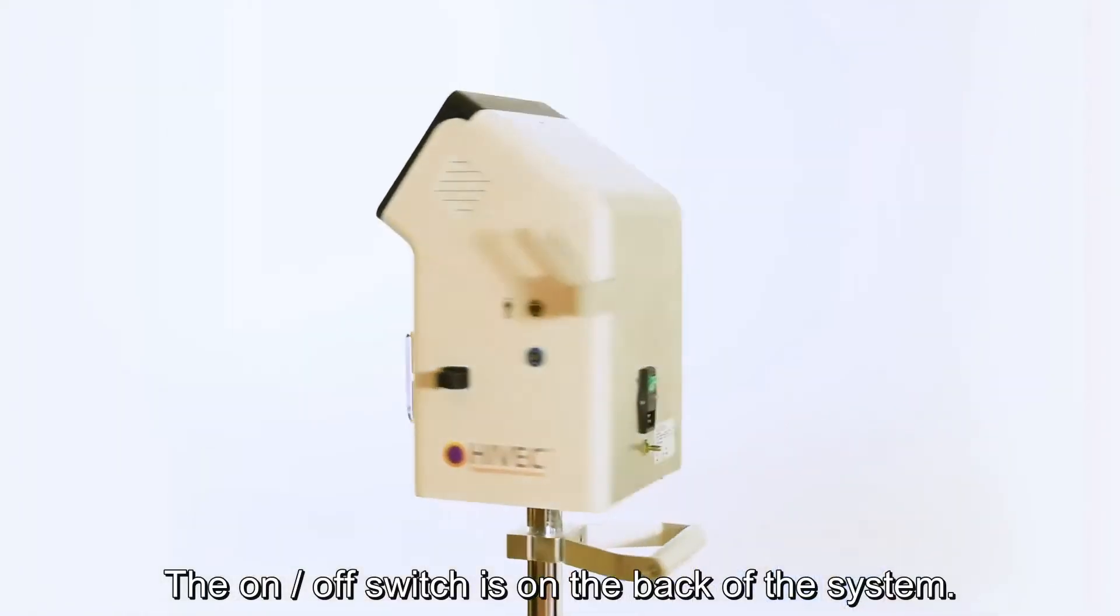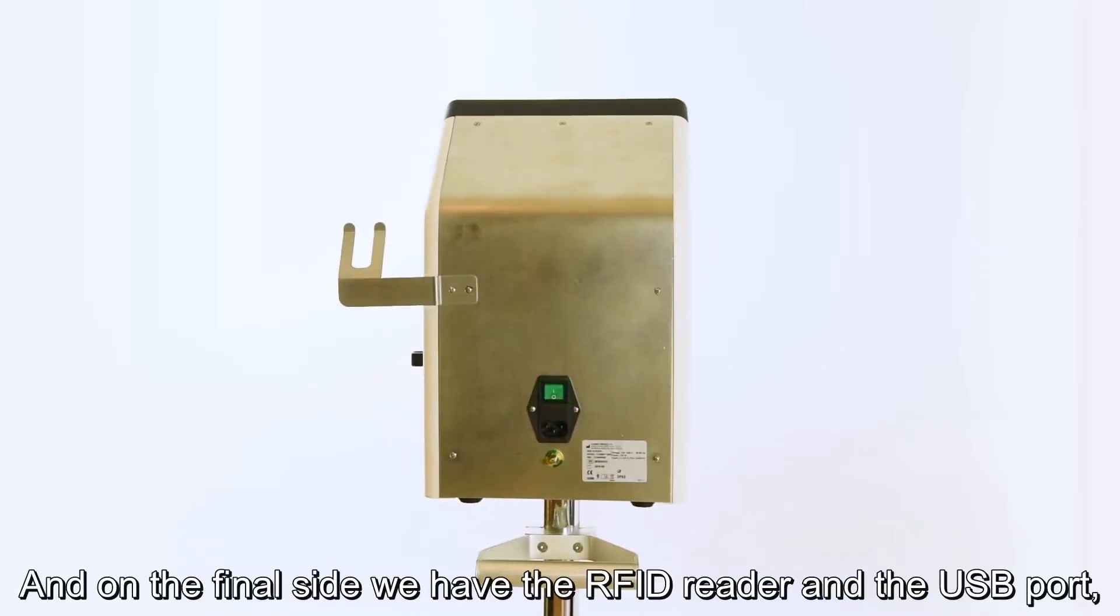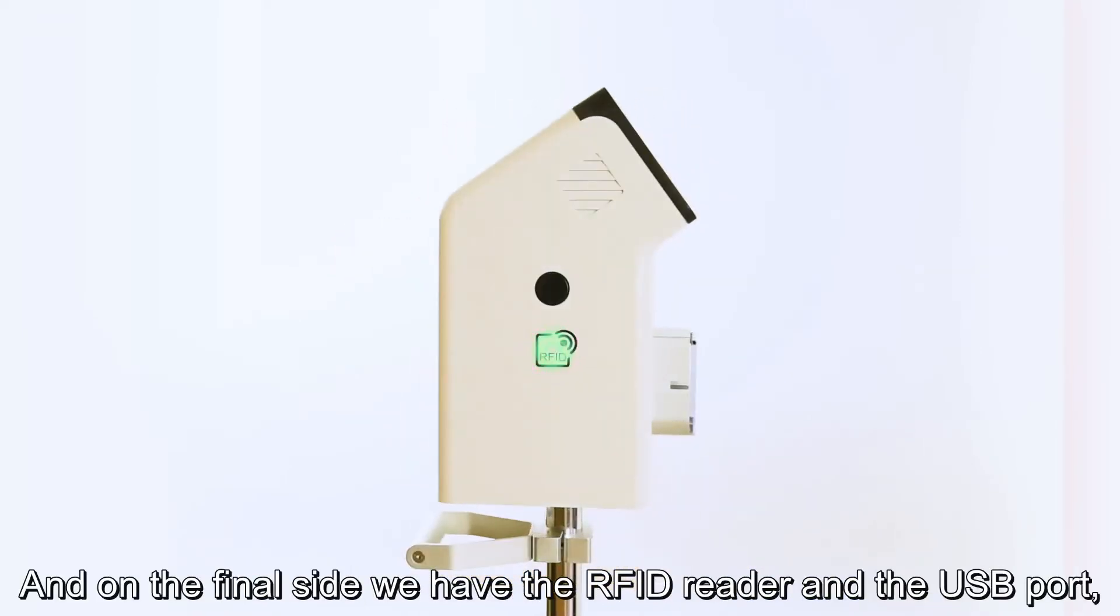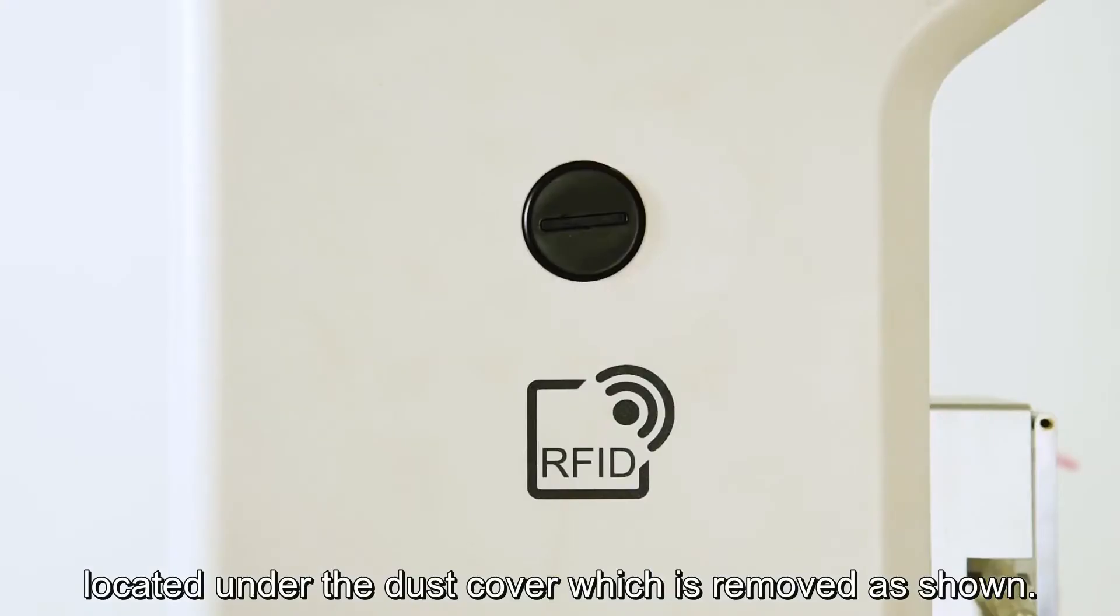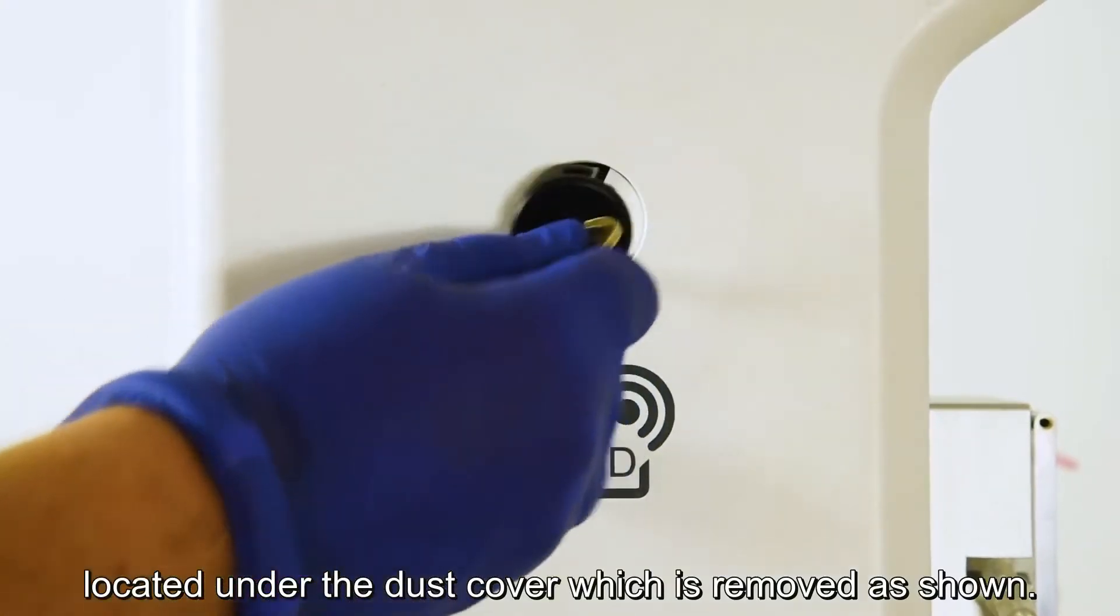The on-off switch is on the back of the system and on the final side we have the RFID reader and the USB port located under the dust cover which is removed as shown.